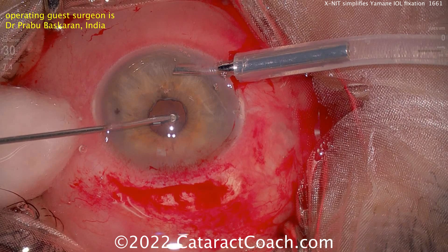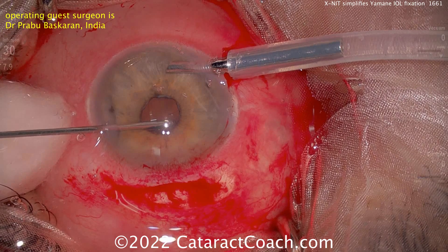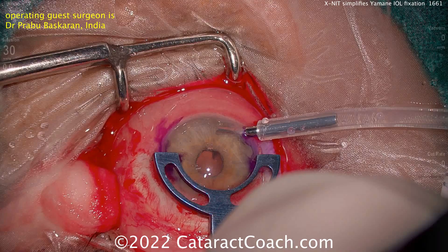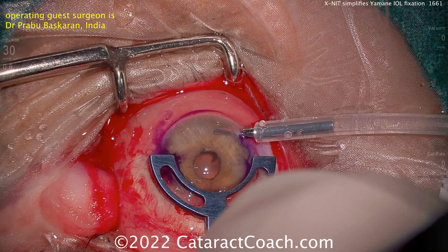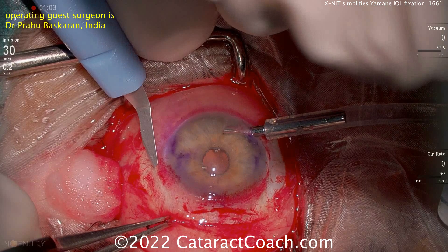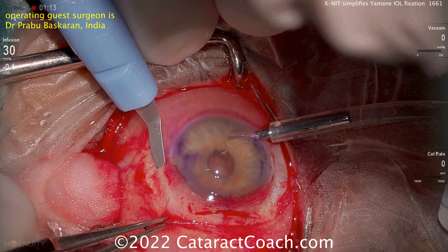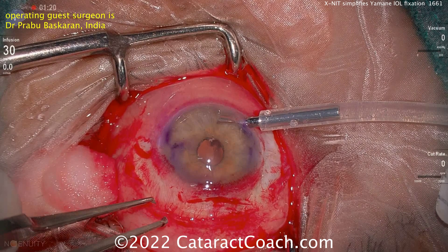Now switching hands, doing another good vitrectomy here. The nice thing with this technique is you're able to engage and place the haptics within the bore of the hollow needle outside the eye. Here's a marking device to mark off 180 degrees apart, giving you good markings for performing the Yamane. Because if these haptics are not 180 degrees apart, that lens is not going to be centered. A small tunnel is being created using this bent blade.